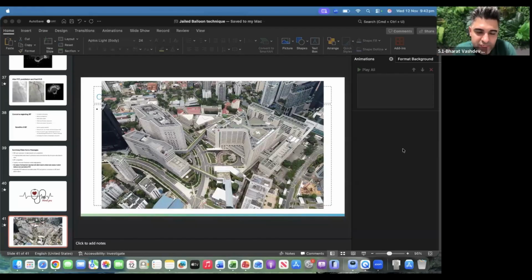So what I always do is I always leave my stent balloon in. Once both balloons are down, I check the flow. And if I see some pinching of the side branch or there's compromise of the side branch, I'll go 2, 4 atmospheres on the side branch balloon. And then you can always go up on the stent balloon to kiss. And when you kiss, then you have restoration of that side branch flow. Then you can remove both and then recross and kiss if you need to.